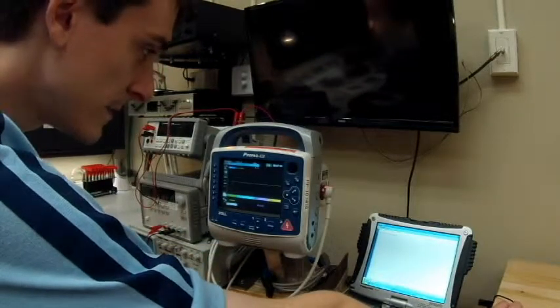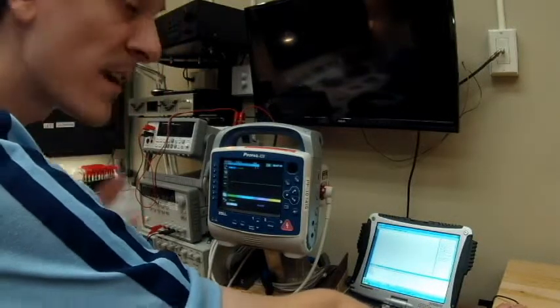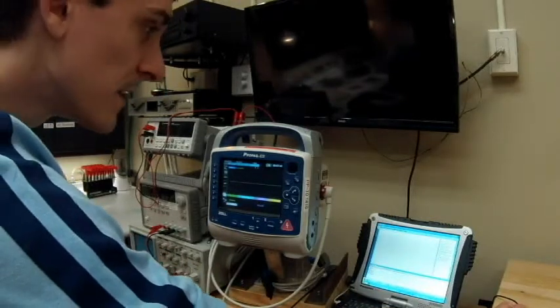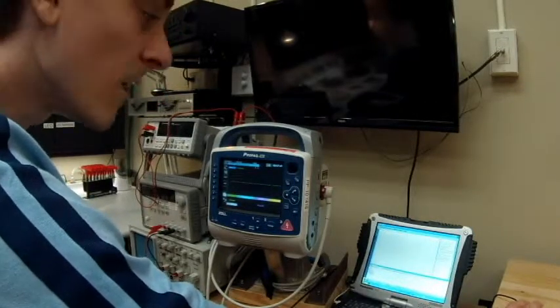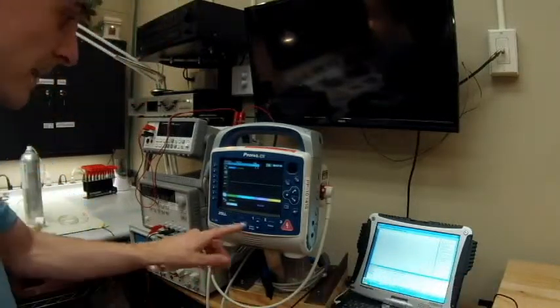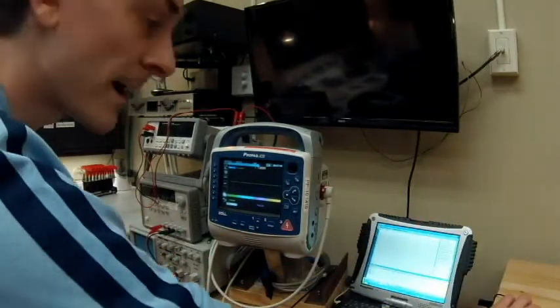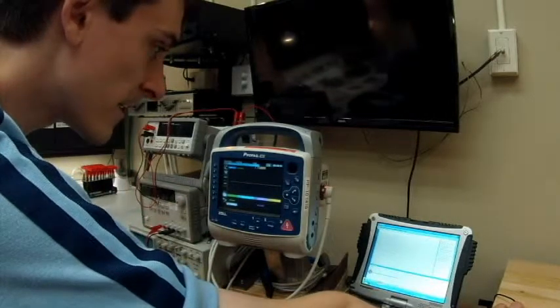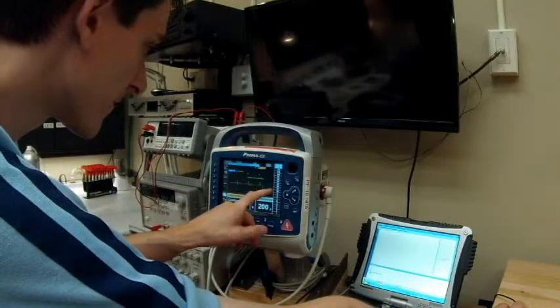It's already been programmed. Once it finds the R wave, it's going to do a shock on the defib. Everything's been set. All I have to do is hit start. Down here there's a sync button — I'll hit sync right now. It's looking for that R wave to sync to so it can shock the patient. We're going to hit start — 'please charge defibrillator.' It's now detecting the R wave.